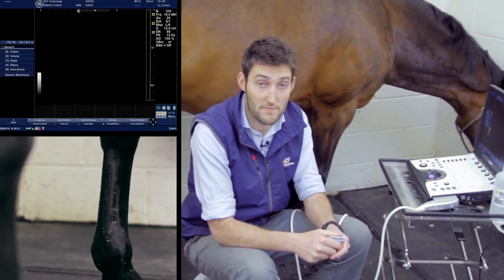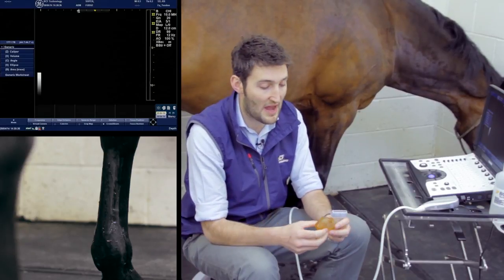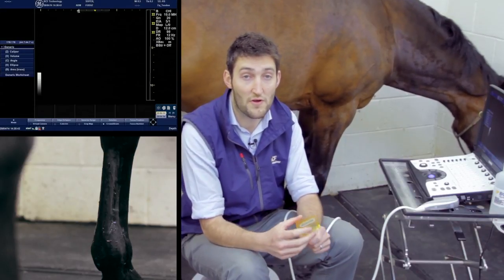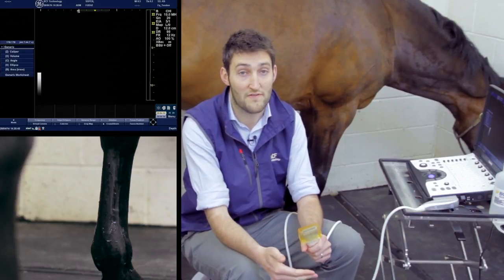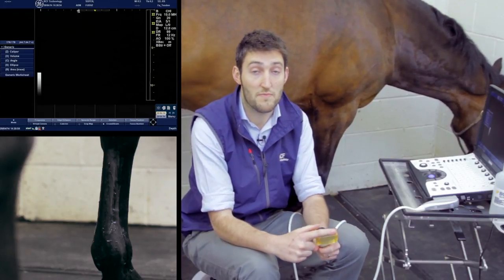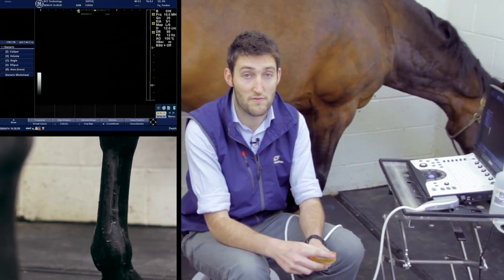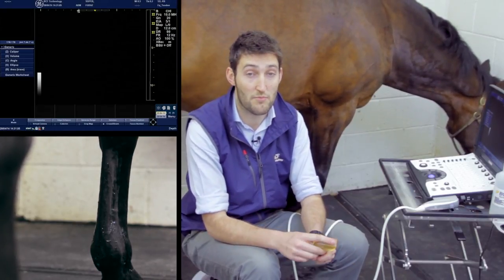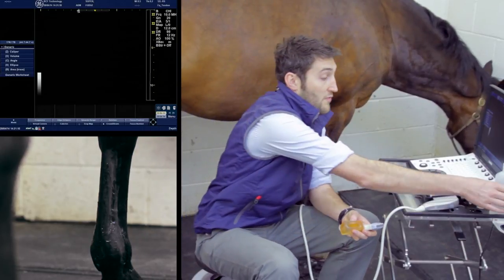For most structures in the metacarpus we're going to be using a standoff on the end of the probe. The one time we might not want to use the standoff is if we're really trying to do a thorough assessment of the suspensory ligament. Some machines don't have an adjustable focal depth, and with a high frequency probe you may not be able to get close enough to the body of the suspensory ligament if you have the standoff on. When we move down to the branches of the suspensory ligament, you will need the standoff back.